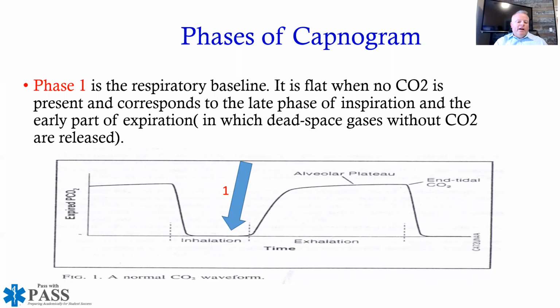What I want to point out to you is this. Remember that this is measuring exhaled carbon dioxide. As you look at this waveform, it seems like it should be reversed. Under normal conditions, you guys do your fire department physical and you have to do your pulmonary function test, right? As I start to blow out, what happens to the waveform? It starts to increase. Well, that's looking at oxygen and pressure. This is measuring CO2 only.